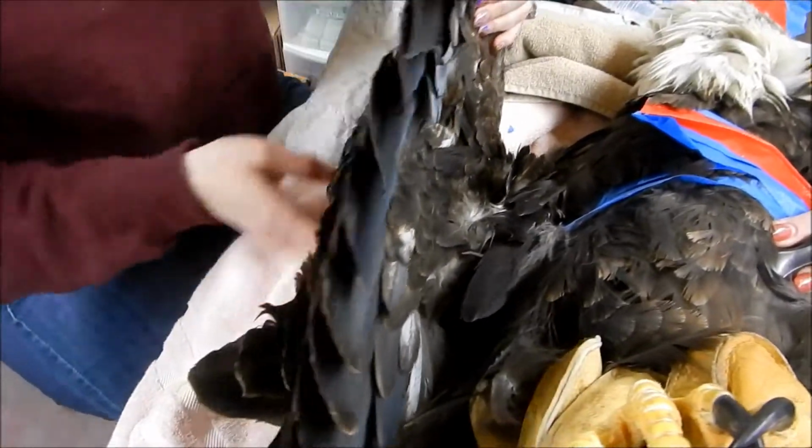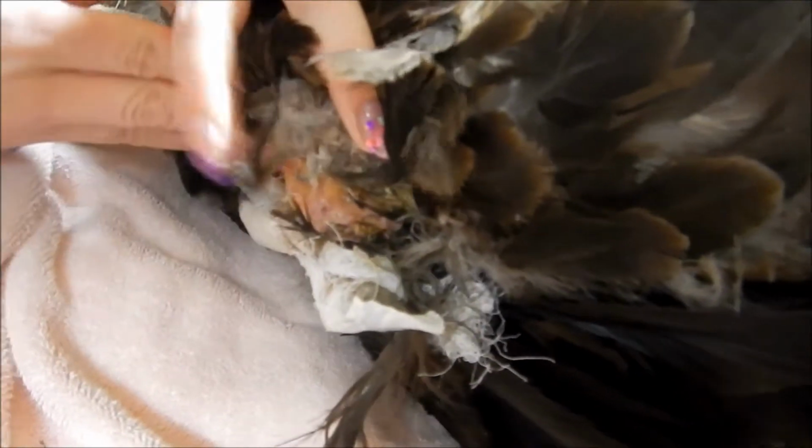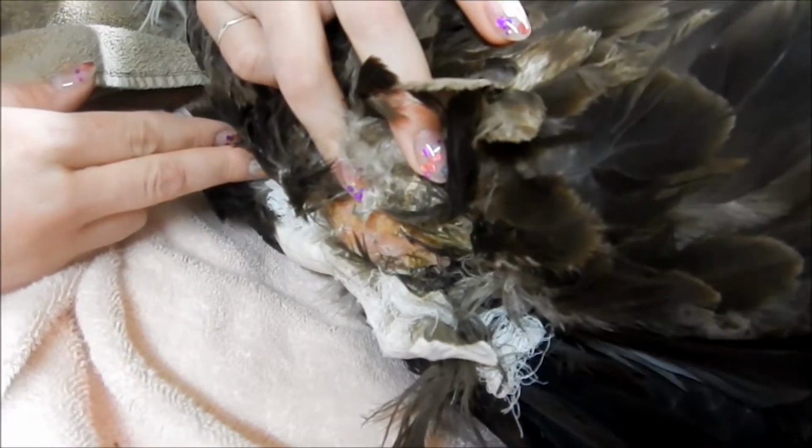So where we have pins is actually on this side over here. So you can see this here is actually our external fixator, and it's actually inside of the bone. And all this gauze here is what we're going to be taking off. We're going to be looking at each pin site, and we're going to be cleaning it and then redressing it.